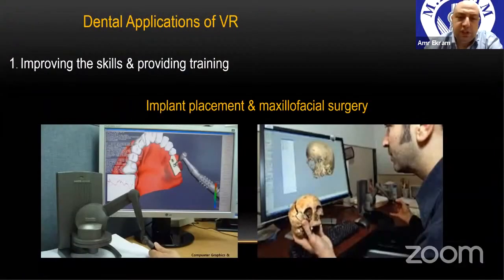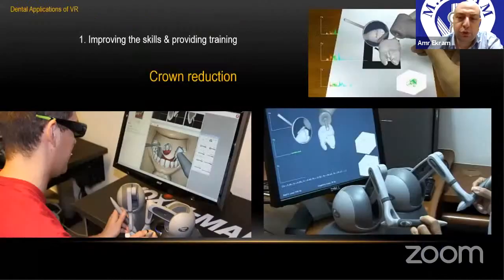It's very beneficial in education. You can get the sense of drilling, for example, implants, making surgery without doing surgery on an actual patient. So its main advantage is in education. Cavity preparations and so on with the haptic device. This is already available. It's not a big deal. Now it's available already in many prestigious and elite universities all around the world.